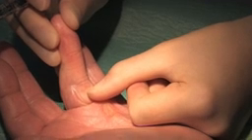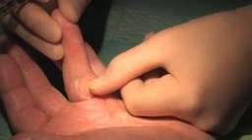We've got a pit in the skin there, so that's the point of attachment of the Dupuytren's to the skin, and we want to go proximal to that, so we don't want to go through that fold of skin, through that track, but we want to use that as our point that will allow things to straighten out. If we go distal to that, then the Dupuytren's will still be attached to the skin and we won't be able to get extension.